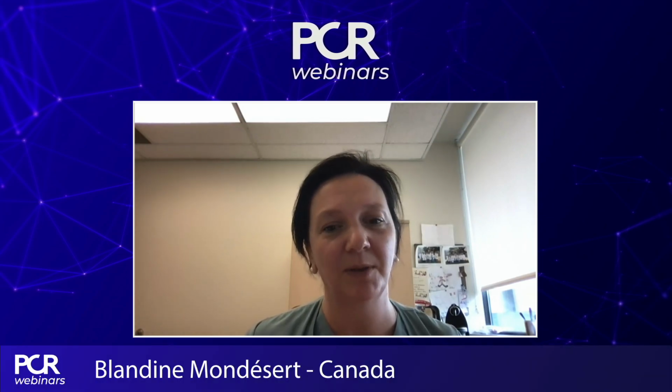I will choose as well the coronary sinus. If the patient has a normal ejection fraction, perhaps I would choose more the leadless pacemaker at that time combined with the sub-Q ICD. And perhaps in that kind of patient with the Evoke and the tricuspid valve replacement, the jugular approach for leadless pacemaker could be an easier way to put the leadless in the right ventricle. That's a very good suggestion.